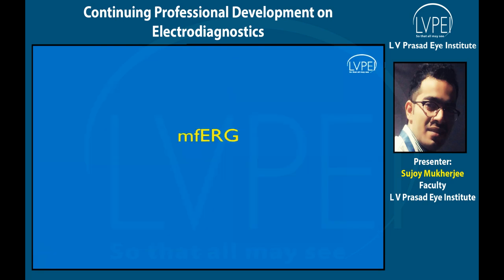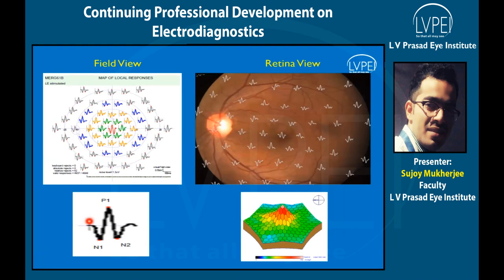So this should be the particular waveform in a normal patient while the patient is fixating or steadily targeting towards the point which is given by the Ganzfeld. But in a nystagmus case, this particular shape may not be well maintained in a topographic shape, but at least we can assess what that would be, and we can correlate with the other eye also.